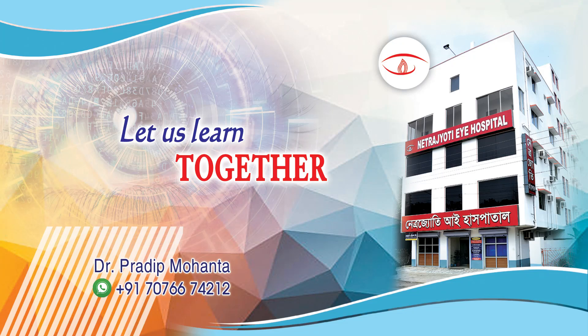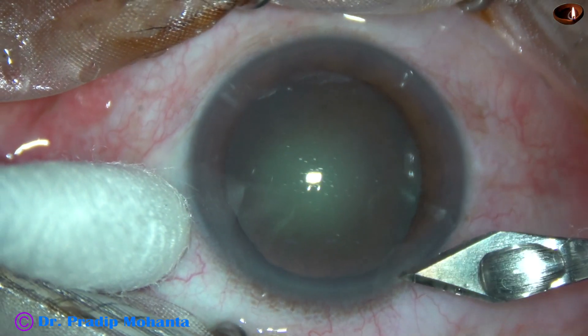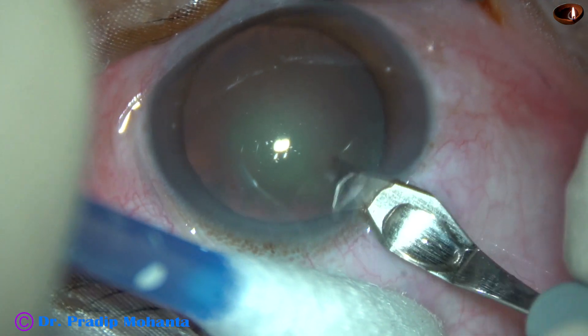Friends, welcome to my workplace at Ranagahat, West Bengal, India. This is a cataract with grade 2 nuclear sclerosis. Let us observe this surgery.